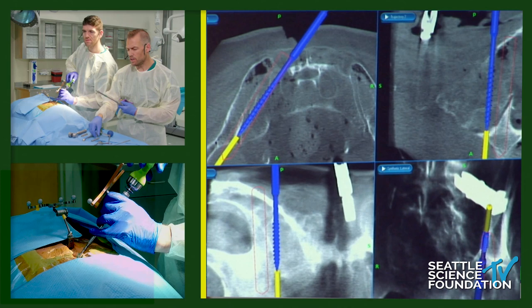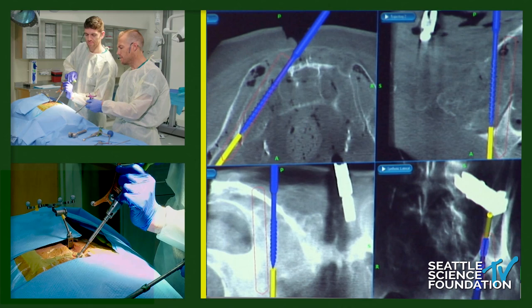We're adding the more proximal screw now — I consider this a counter-rotation screw. It also has the tulip head so it can be incorporated into our construct.